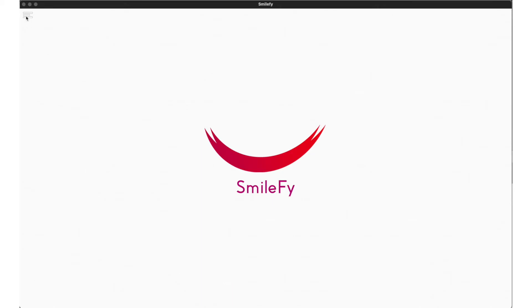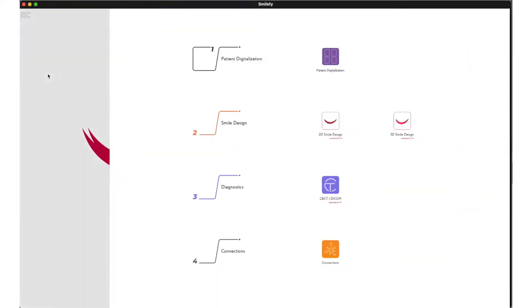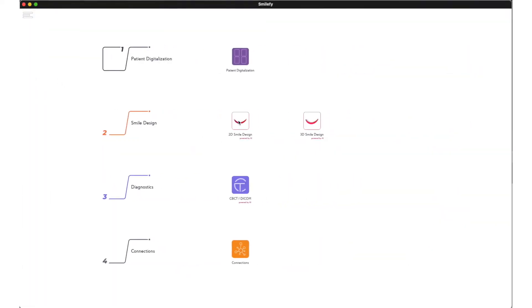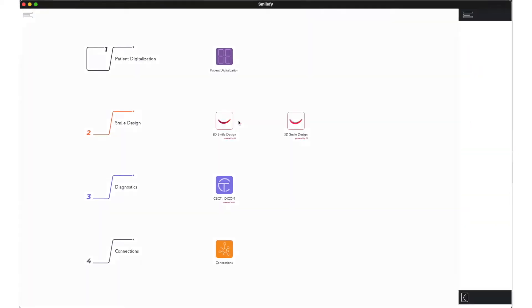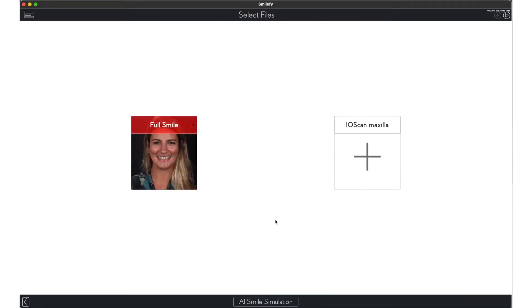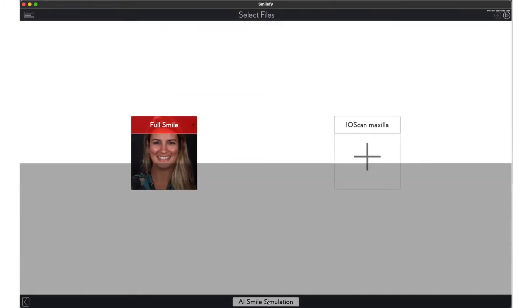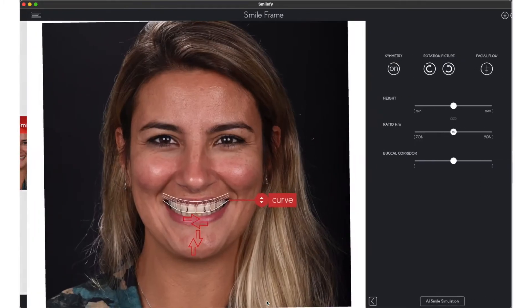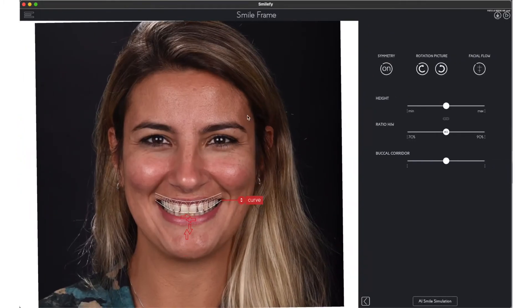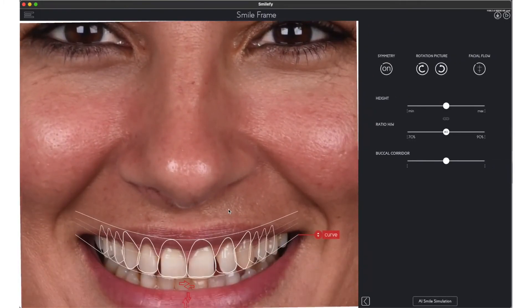We start with a simple smile simulation using a full smile picture. Click AI Smile Simulation. SmileFi performs a face analysis and sets the smile frame automatically according to the facial characteristics.